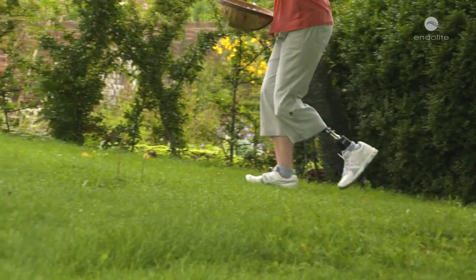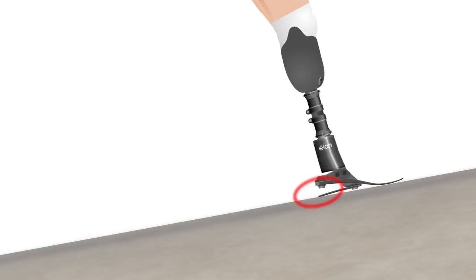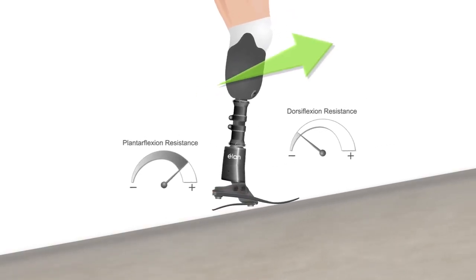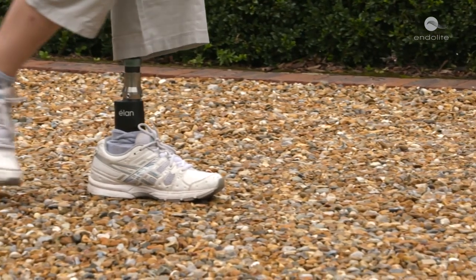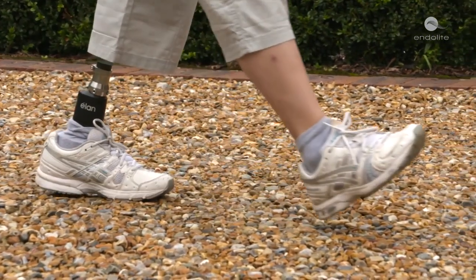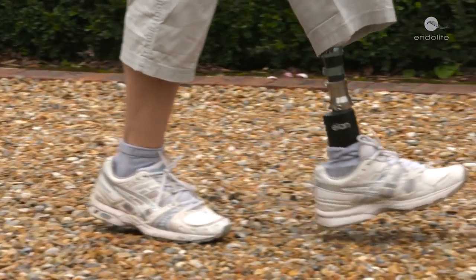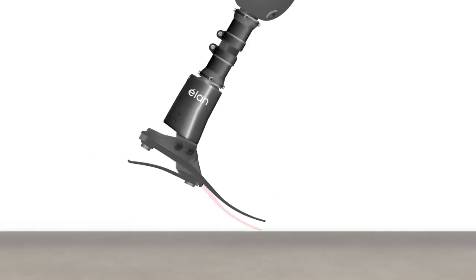When walking fast or up slopes, the heel stiffens allowing for more optimal energy storage and return. This aids forward momentum and reduces the effort needed to walk faster or uphill. During swing phase — the time when the foot is not in contact with the ground — the ankle remains in a toe-up position, which gives increased toe clearance on every step, meaning the user is less likely to trip, stumble, or fall.